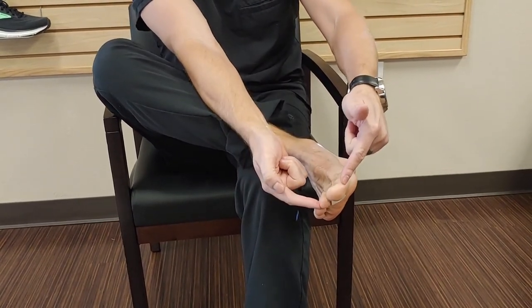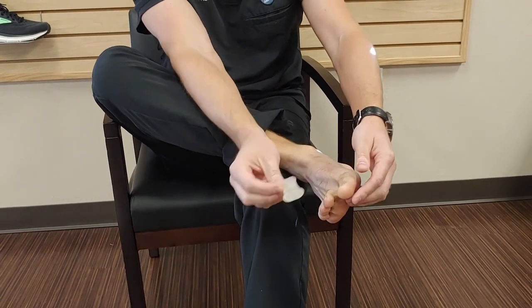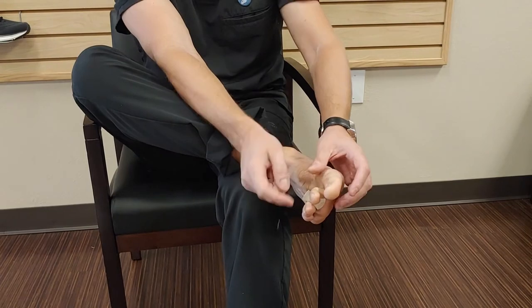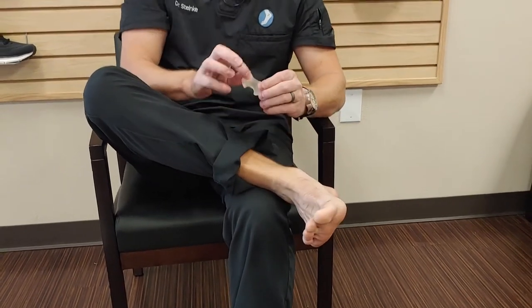Again, that's designed to stop the two toes from rubbing together. There are different sizes of these, so if you have lesser toes that bother you, sometimes we can put these between those smaller toes as well. And that is called a toe spreader.